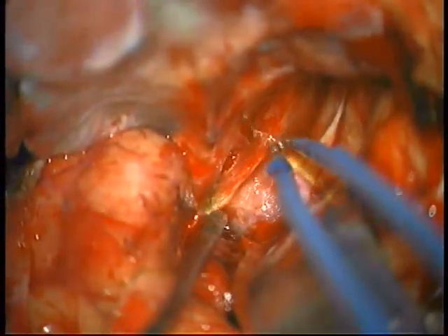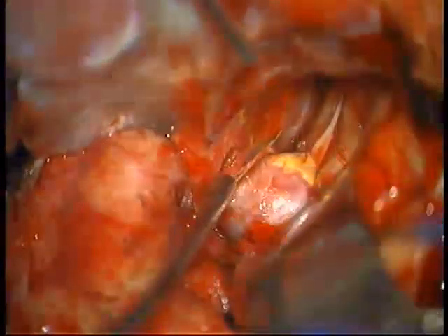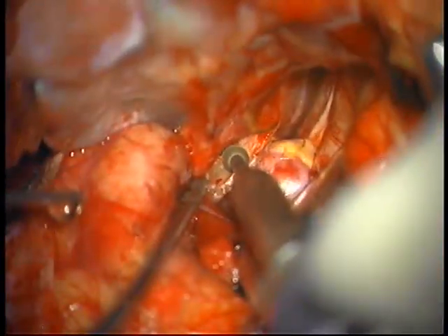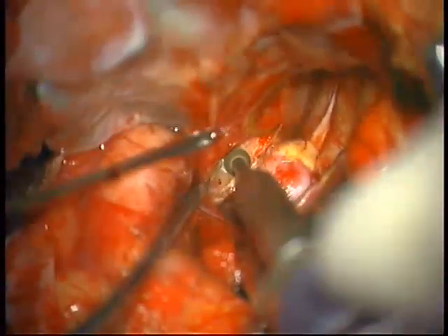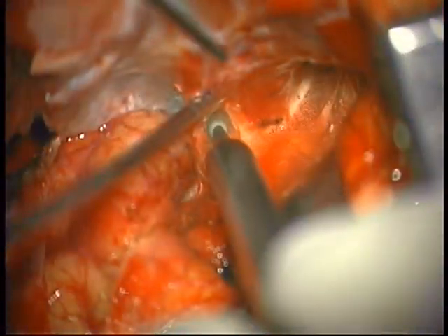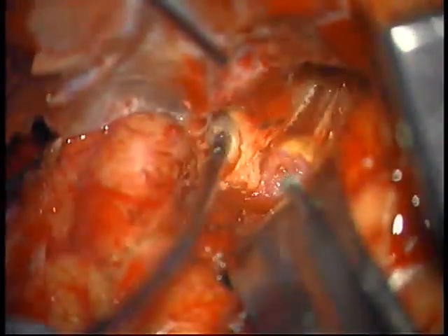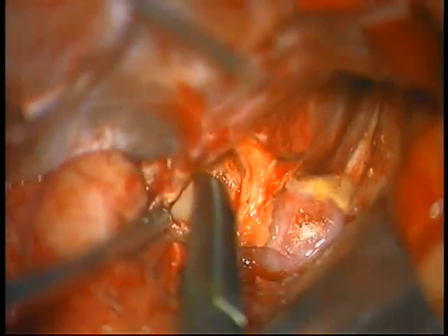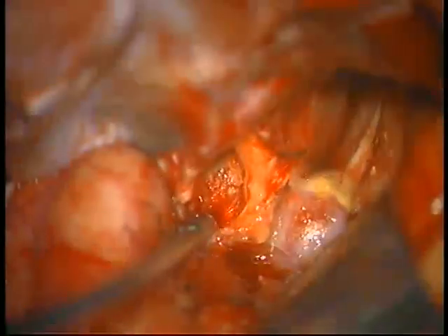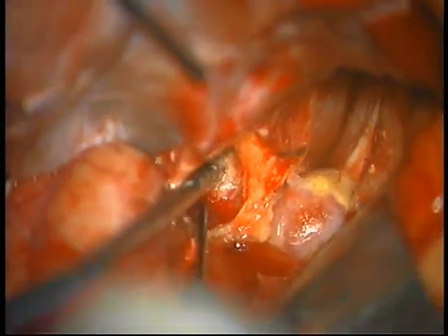The dura over the optic nerve and the tip of the clinoid process is coagulated and divided. With the aid of a diamond tip drill, the rest of the anterior clinoid process is drilled away. The tip of the clinoid process is obtained in one piece. Underneath the clinoid process is the roof of the cavernous sinus.